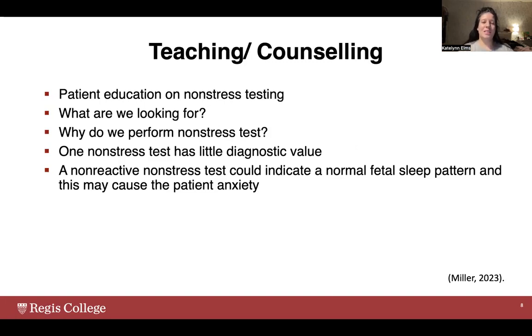One non-stress test has really little diagnostic value. We're going to need to collect more data. We can't just say from one test unless the baby has a prolonged deceleration or the heart rate drops super low and isn't coming back up. We can't tell you definitively. We're going to need to gather more information.